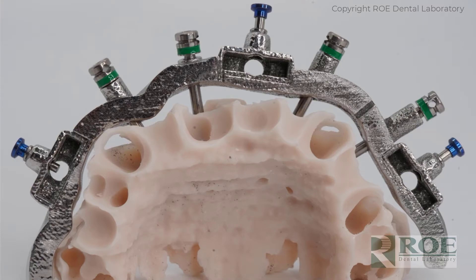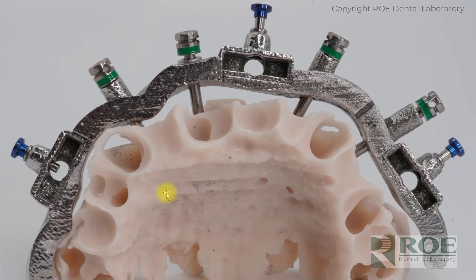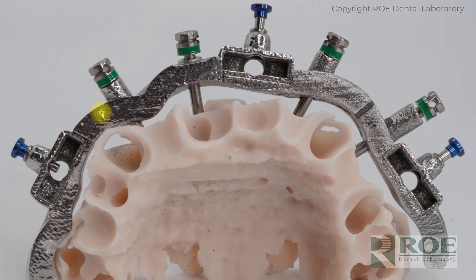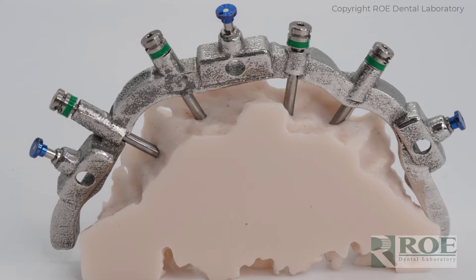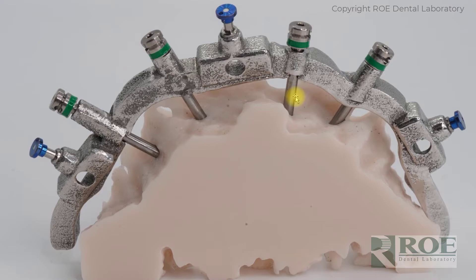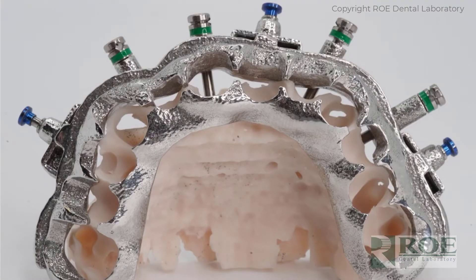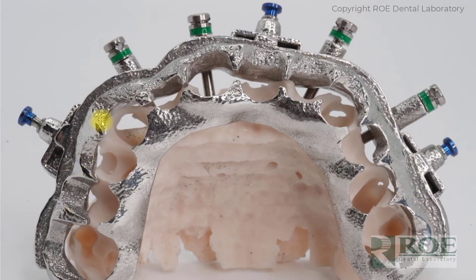This is floating guide technology. The guide never touches bone, unlike plastic guides or big-footprint guides that hug the lingual and buccal and require bone reduction to get seated. Those are very challenging for FP1 situations. This is all pin-supported, pin-trajectory floating guide technology. From the lingual view you can see how easy this would be to seat — you don't have to reduce bone first. The pins go transcortical using a step-down drill-and-pin combination so that when you place these pins you are tapping into the cortical plate. It's very secure.